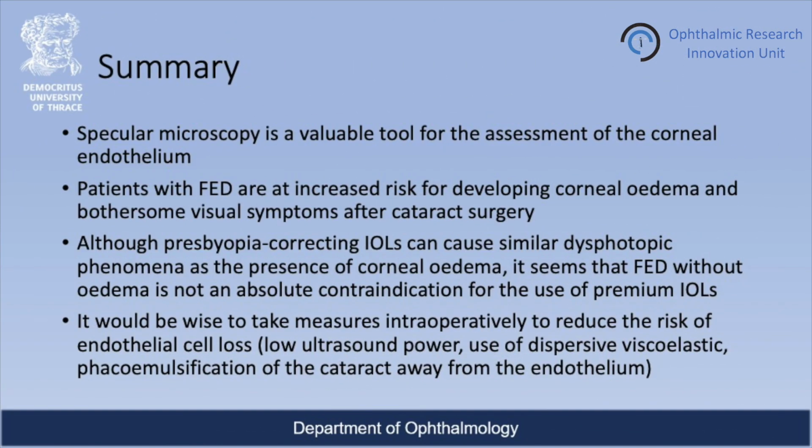To summarize, specular microscopy is a valuable tool for the assessment of the corneal endothelium. Patients with Fuchs endothelial dystrophy are at increased risk for developing corneal edema and bothersome visual symptoms after cataract surgery. Although presbyopia-correcting intraocular lenses can cause similar dysphotopic phenomena as the presence of corneal edema, it seems that Fuchs endothelial dystrophy without edema is not an absolute contraindication for the use of premium intraocular lenses.